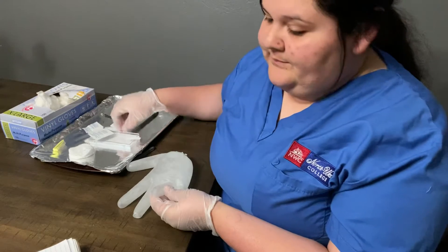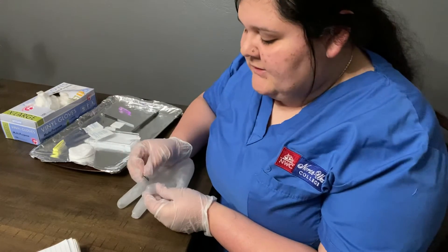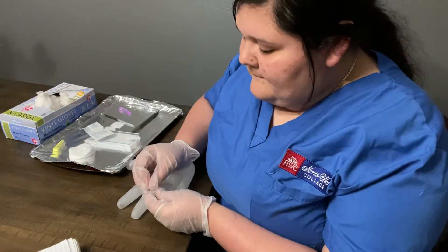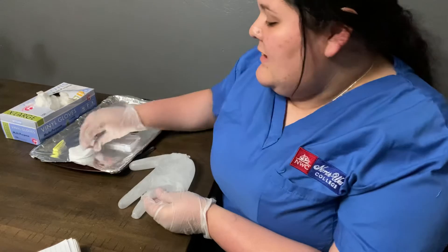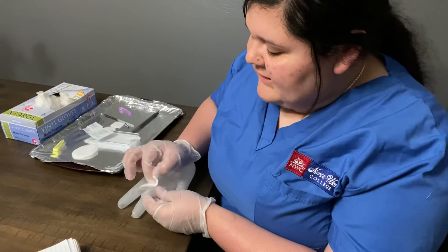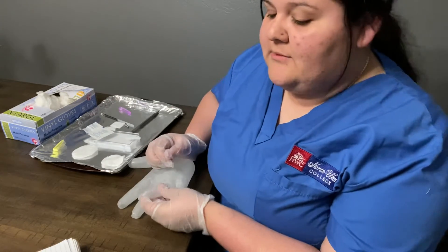Once the finger is prepped, I'm going to go ahead and take the lancet to the side of the finger and it's just going to poke it. I'm going to be poking on the side of the finger because you never want to poke in the middle. Now that it's been poked, I'm going to get my gauze and wipe the side of the finger. You always want to collect and discard the first wipe of blood — you don't want to use that.